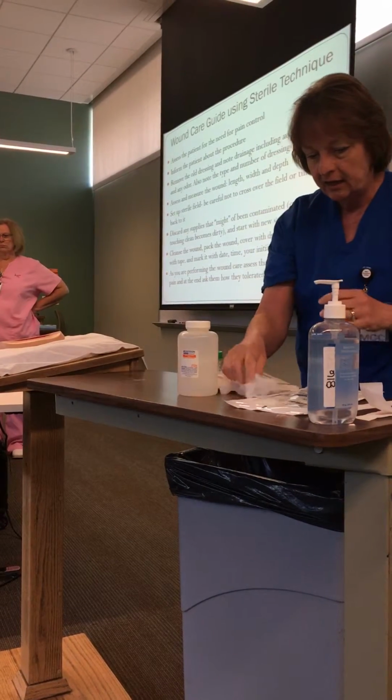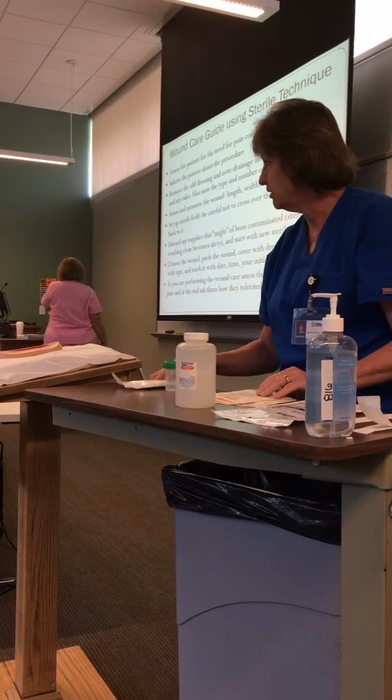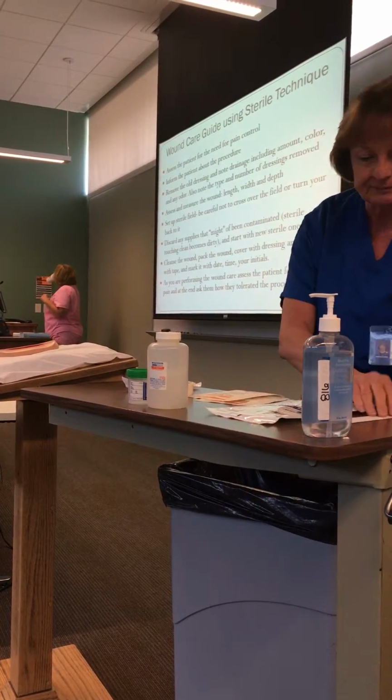Okay. Now it's time for me to... did I do that right? Did I follow the steps correctly? Make sure I did. Okay, good. All right, so now I've got to set up my sterile field.